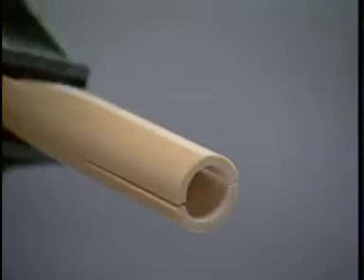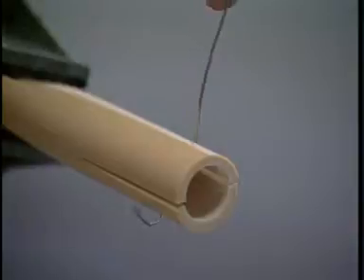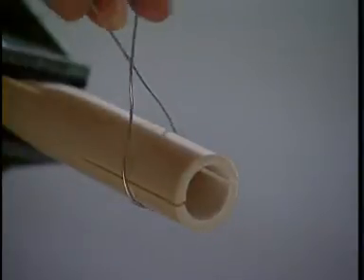Cerclage wire without eye. A 15 centimeter strand of wire has been cut from the coil. For an alternative method of wire passing, curve one end of the wire and pass it around the bone. The two ends of the wire are twisted together two or three times by hand.